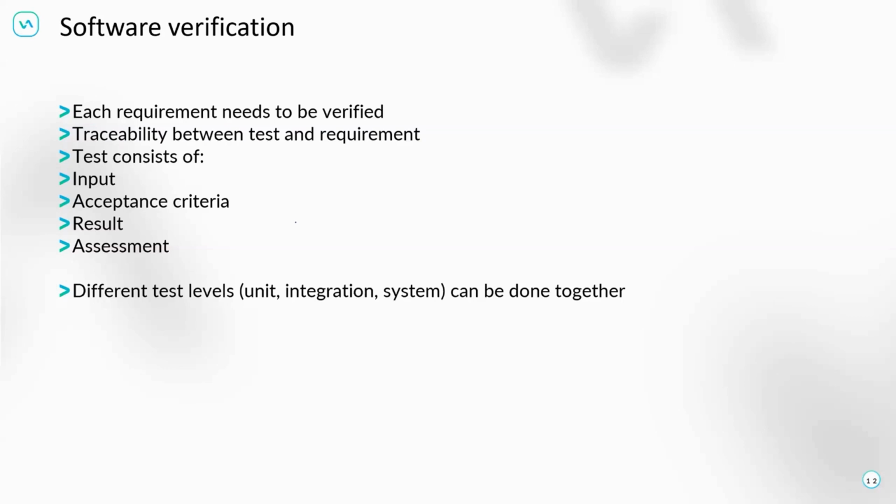Cybersecurity. The South Korea Medical Device Agency has a very nice list. I can give you access to that list as well in the translated version. It shows what kind of methods are good to be used for a certain software risk, which are mandatory, and which are totally optional for a particular risk.